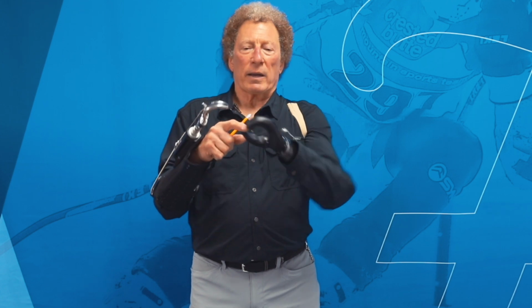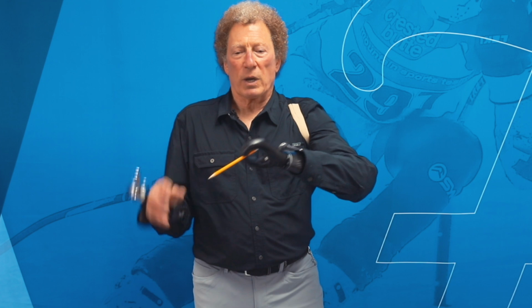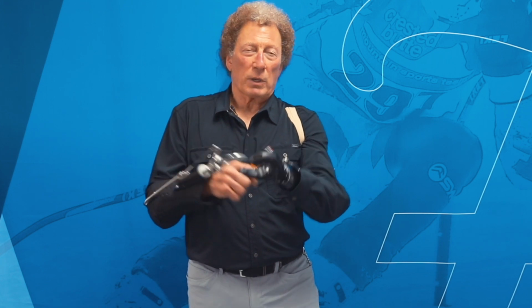Well, where do I get that? If I'm grasping onto an object, I'm physically creating force, like an active pair of pliers on the end of my arm as opposed to a passive vise. Active pliers, passive vise. This holds on, I have to hold on with this. But I have a tremendous amount of power with this. All the power that I can generate through the cable and the harness, I can put into this device.